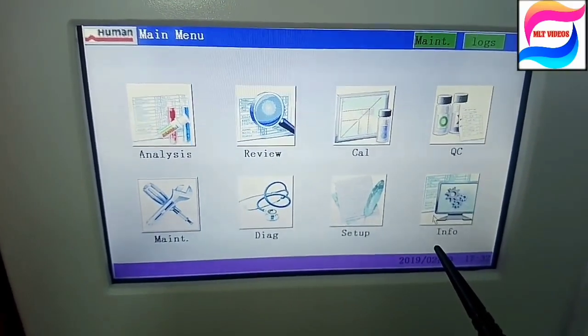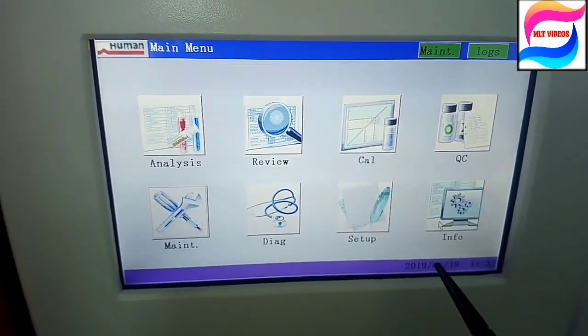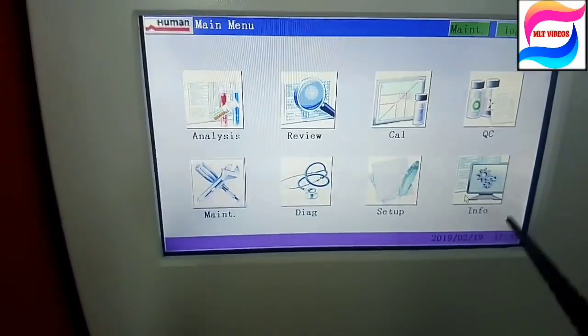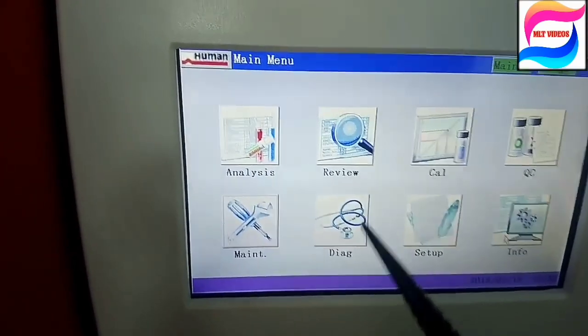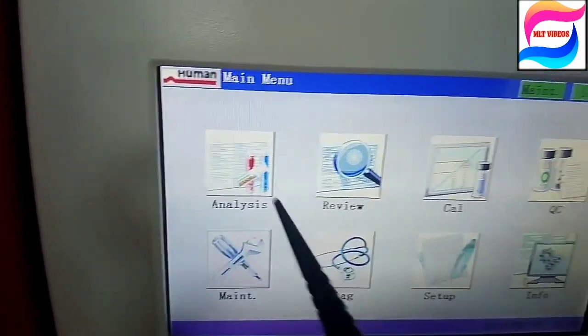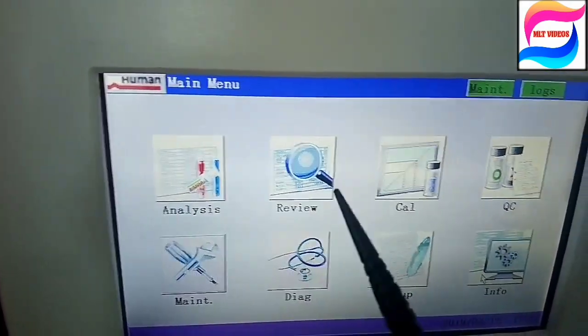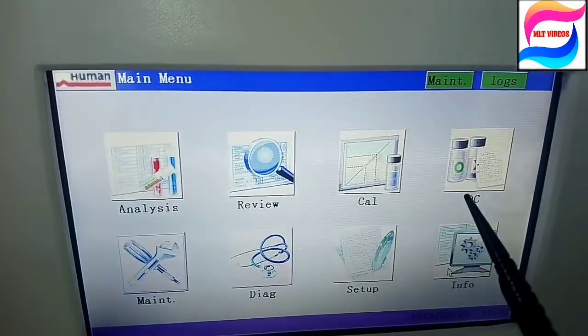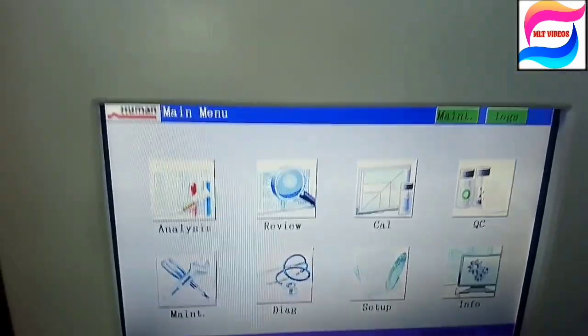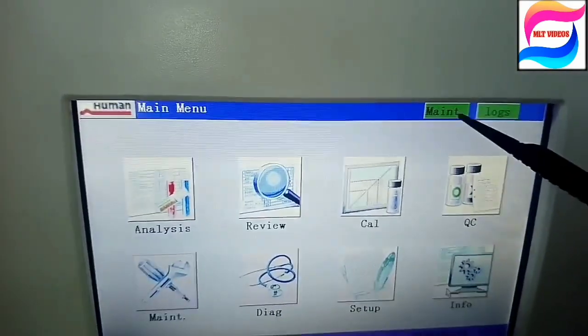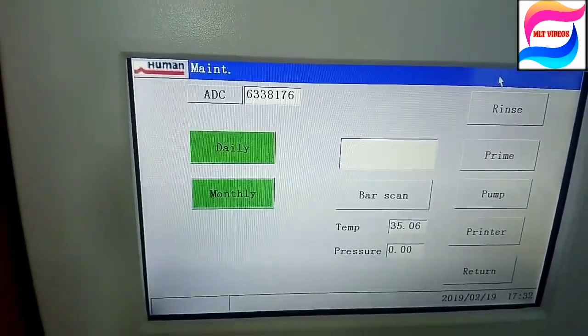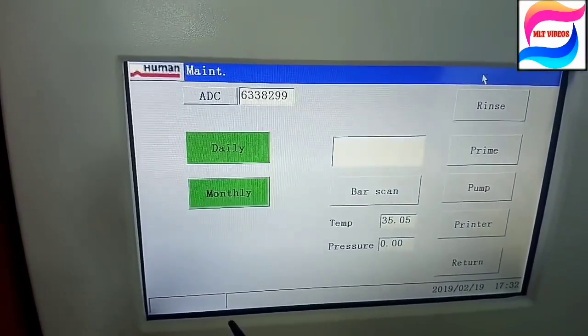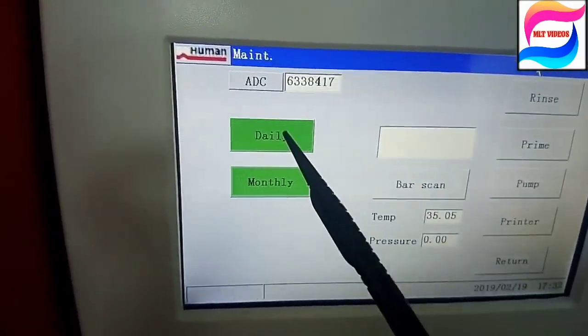Then Maintenance, Diagnostic, Setup, and Information. In Setup we will go and if we have to prime reagents we will go in Setup. H reagent, B reagent, A reagent, or column or filters that we will use.